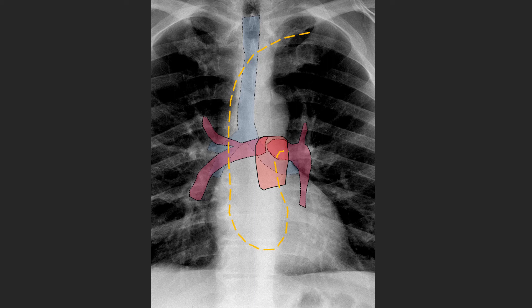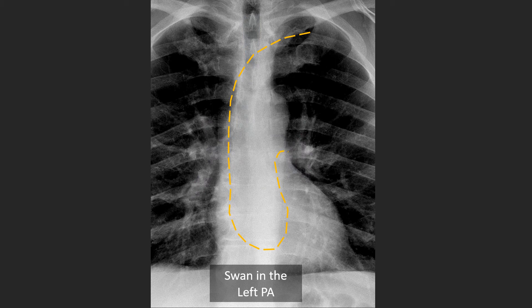Here's another catheter coming down — we can see it entering the main pulmonary artery but going up and over the left main stem airway and curving to the left. We can see this Swan-Ganz catheter in the pulmonary artery and, when we subtract out the anatomy, notice its location above the left main stem airway, which we'd see in this area here.